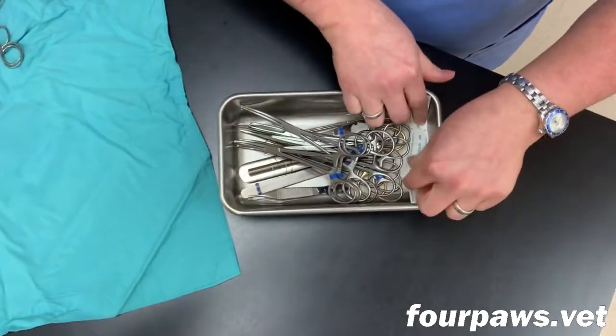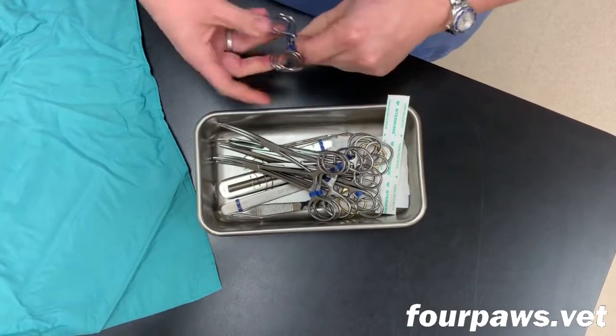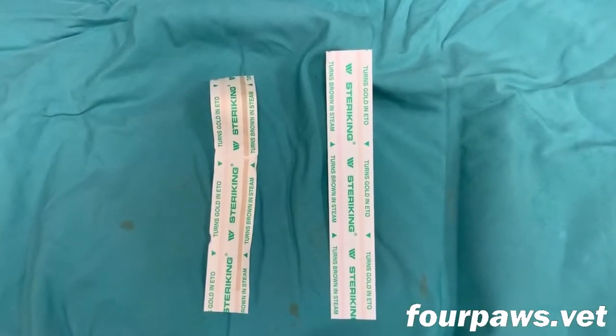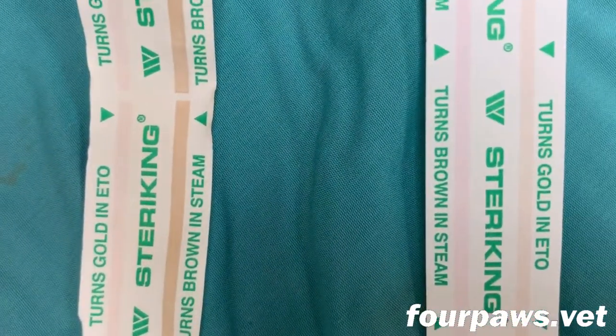An indicator strip is also placed inside the tray, as this will help us determine whether or not the pack was properly sterilized when it's unwrapped. On the right is a strip that has not been sterilized yet, and on the left is a strip that has been sterilized.